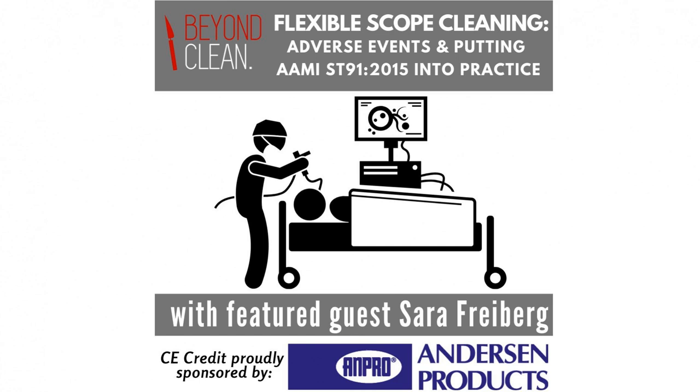Brushing is such a huge issue, and I'm sure you've seen this as well, Justin, staff maybe not brushing all of the channels. I sometimes see them brushing the straight suction channel, you know, it has that bifurcation, and they brush that 90 degrees, but they sometimes forget there's a 45-degree angle within that channel as well.